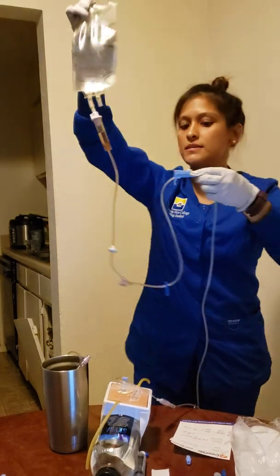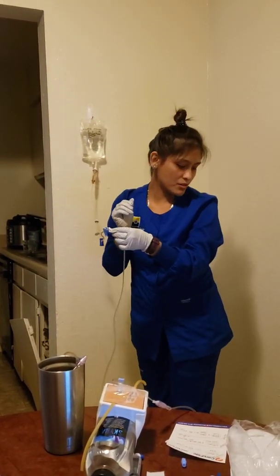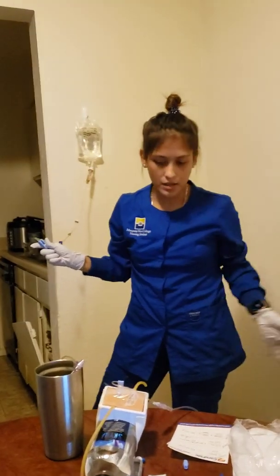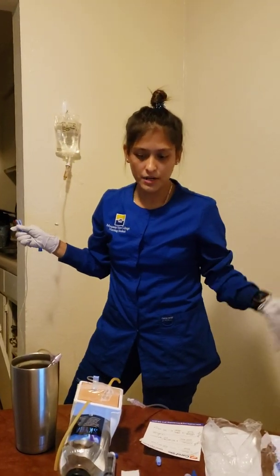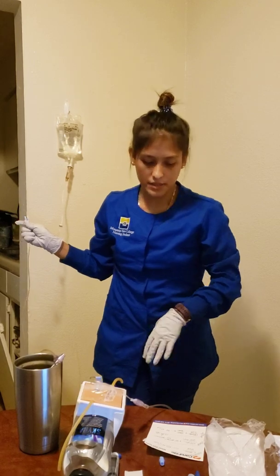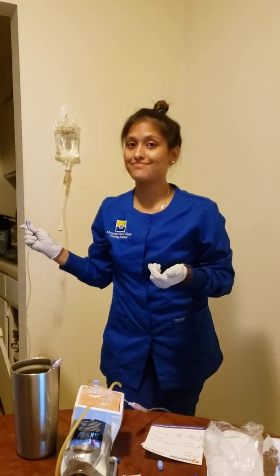And that's that. And so I labeled and did all that, okay. And again, I want to make sure that I said that I would unclamp everything once I've done my third check. And I'm ready to give this to Miss Chi. Unclamp her IV here and everything's good, and so she's receiving it well, and I think that's it. Thank you.